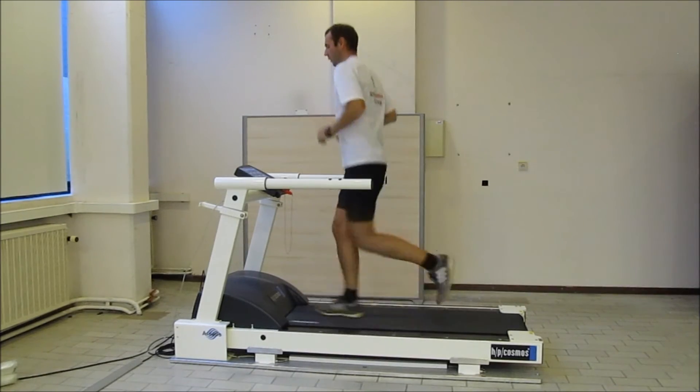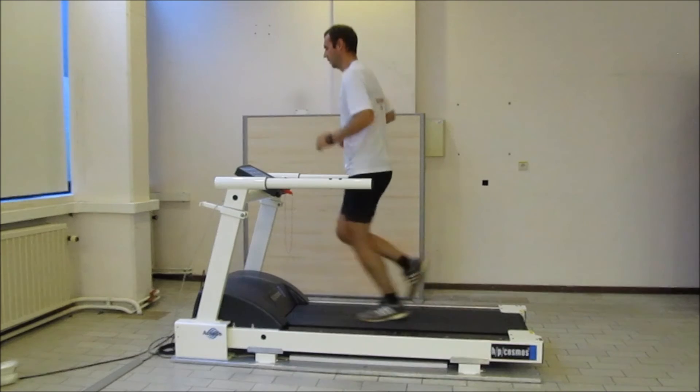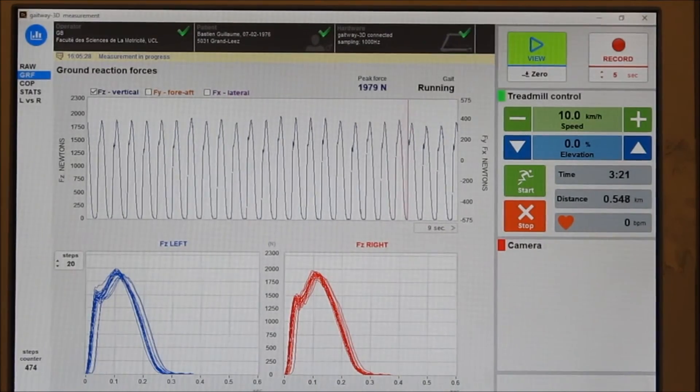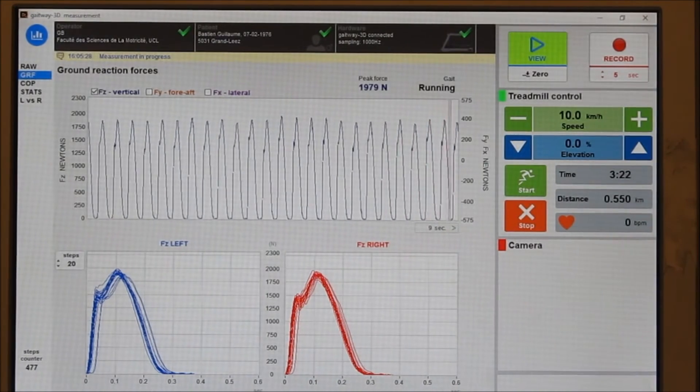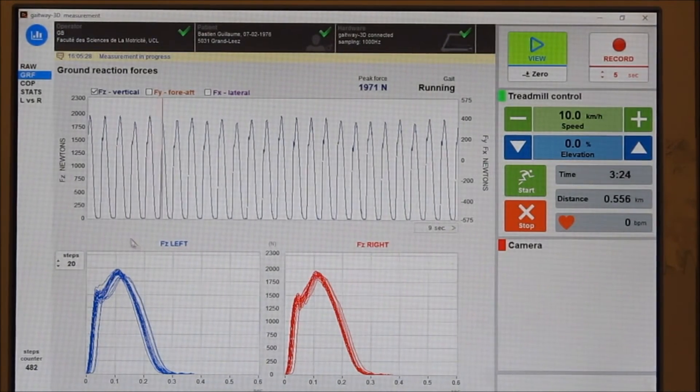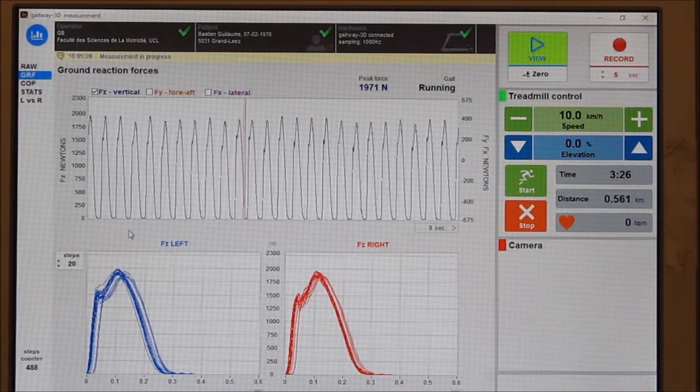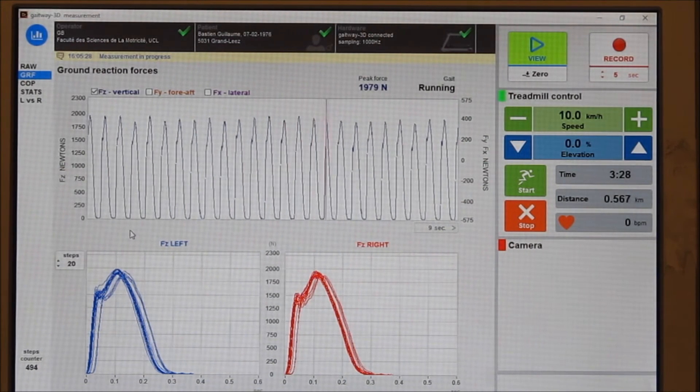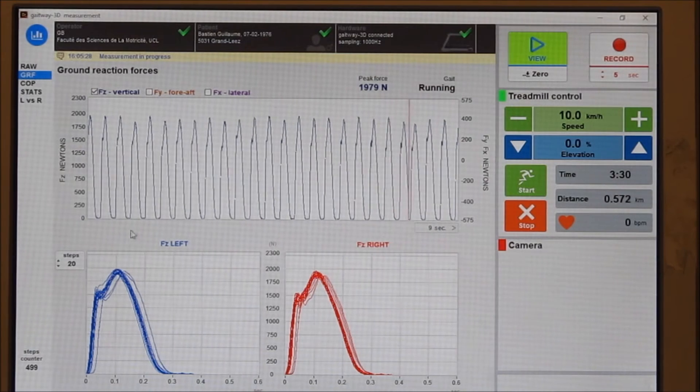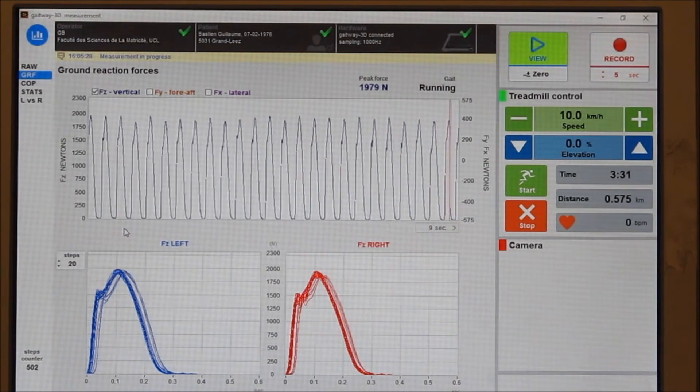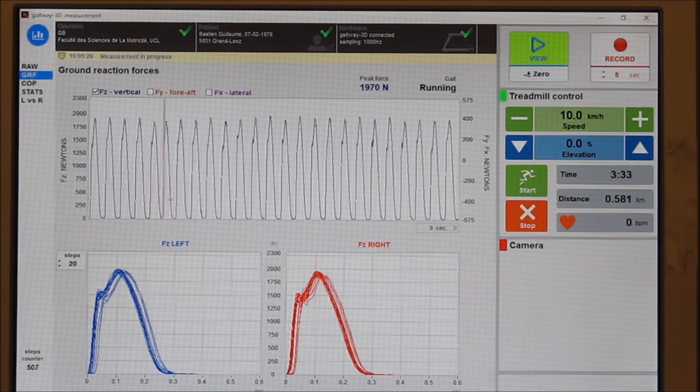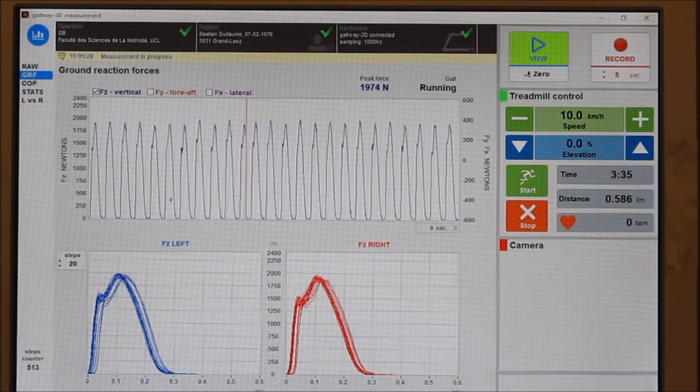At higher speed, the Gateway system detects that the subject is now running. The ground reaction forces are also displayed together with the vertical force under each foot. The pattern is now different and also displays a very moderate foot slap for the subject. The scales of the plot can be changed easily by using the mouse wheel.